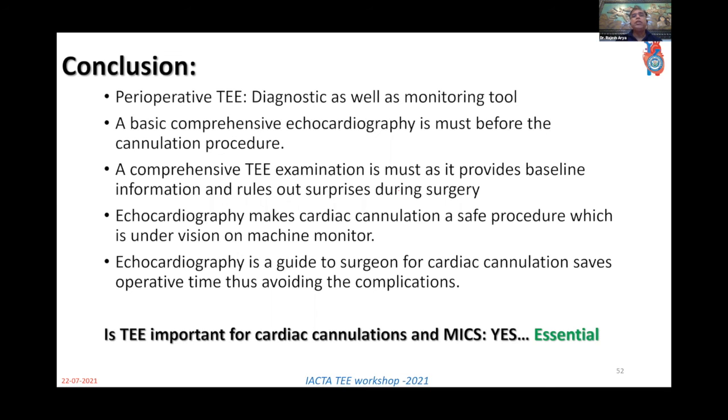And so to conclude, perioperative TEE is a diagnostic as well as a monitoring tool. A basic comprehensive echocardiography is a must before a cannulation procedure is performed. A comprehensive TEE examination is a must as it provides baseline information and rules out surprises during the surgery. Echocardiography makes cardiac cannulation a safe procedure, which is under vision and the vision can be on the monitor screen of the echo machine. And echocardiography is a guide to the surgeon for cardiac cannulation. It saves the operative time and thus avoids so many complications.